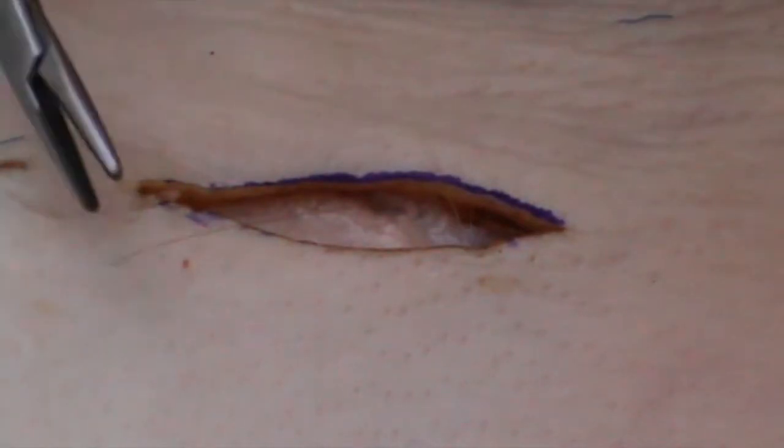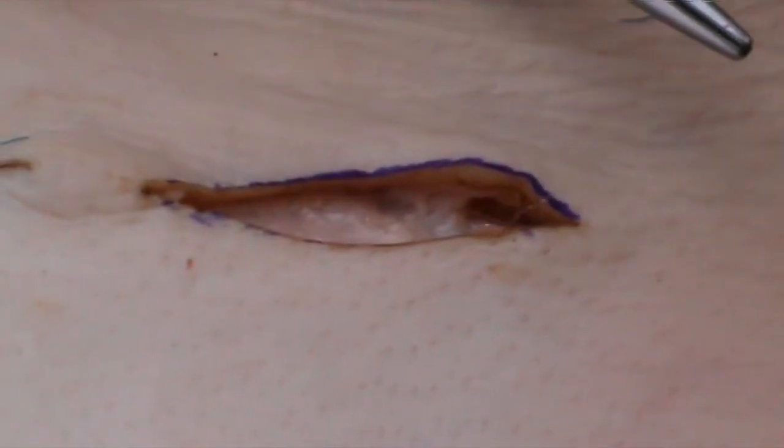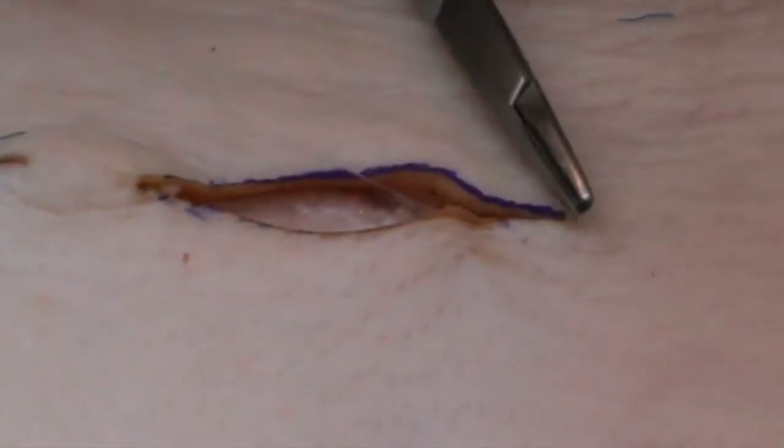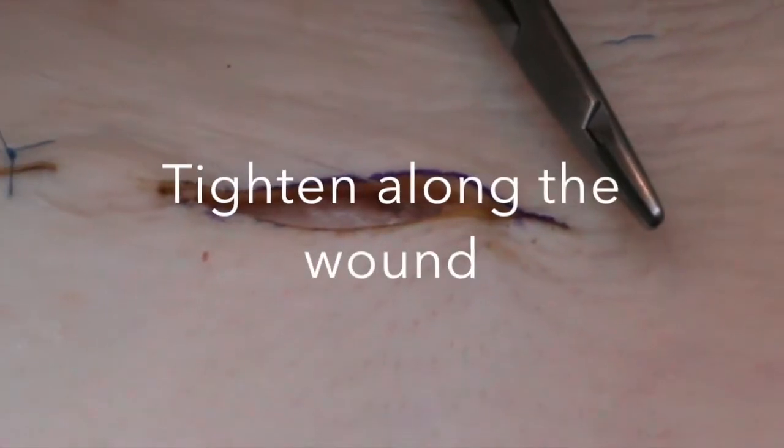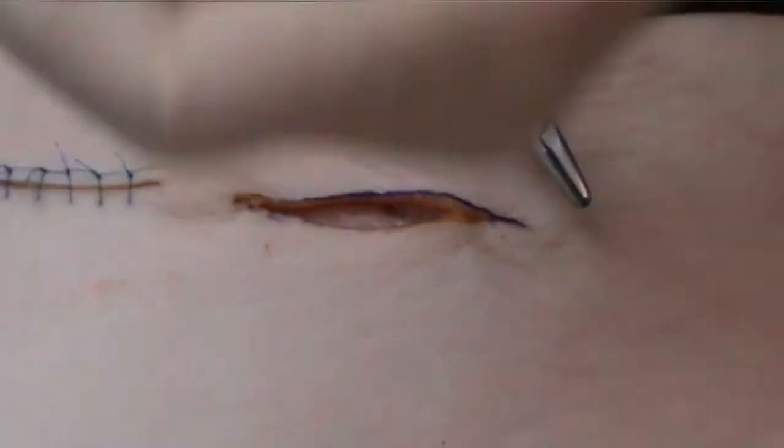This suture, as you can see, being a monofilament is transparent and difficult to see, hence the area that I've pigmented. And this is then brought together, and as you can see, you do the opposite to close the wound.